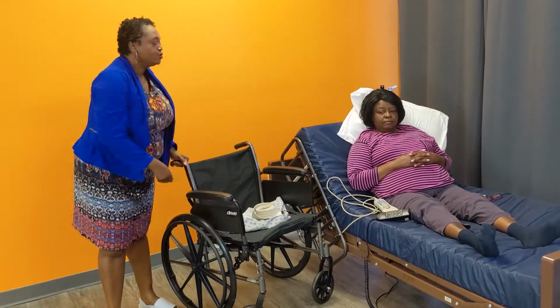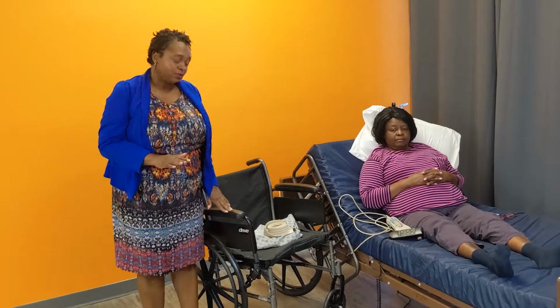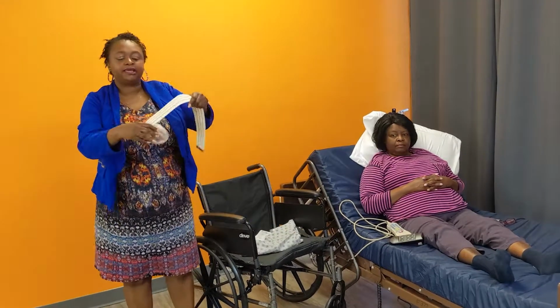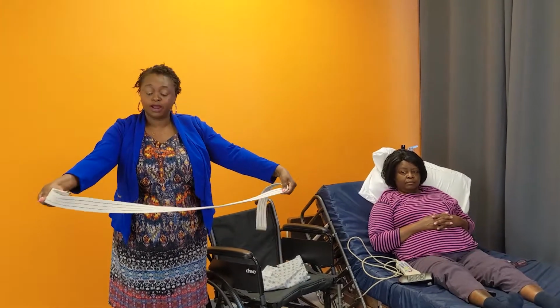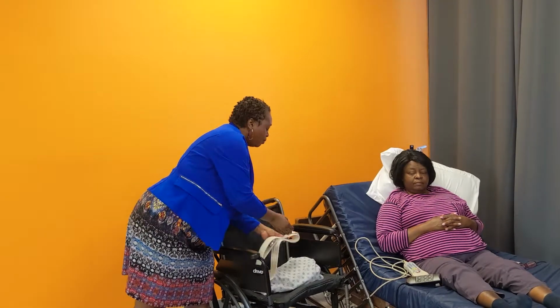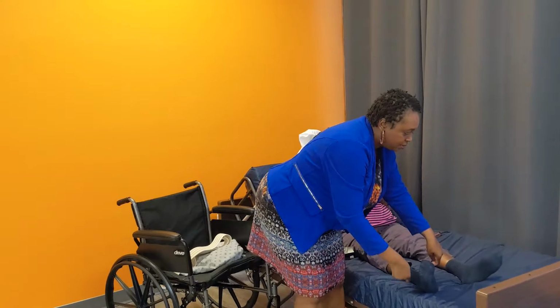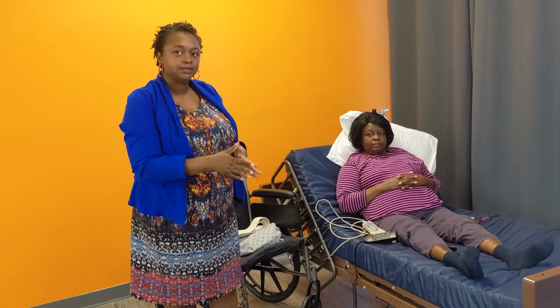So a lot of times you have to look at your body mechanics and the patient's body mechanics. I have my wheelchair here. I have a gait belt. This is what a gait belt looks like, and we'll go over how to put that on. I have the patient's robe, which I'll use as a Johnny. Our patient here is wearing non-skid socks, so we're not going to take her socks off. On this checklist you could put non-skid socks on. That's another safety technique so the patient doesn't slip and fall.